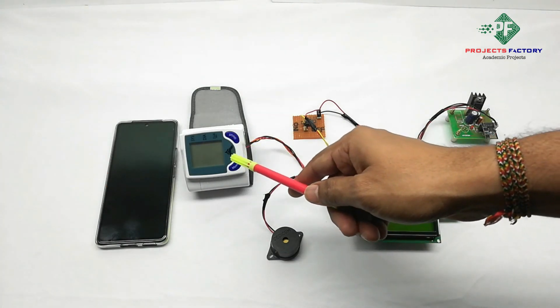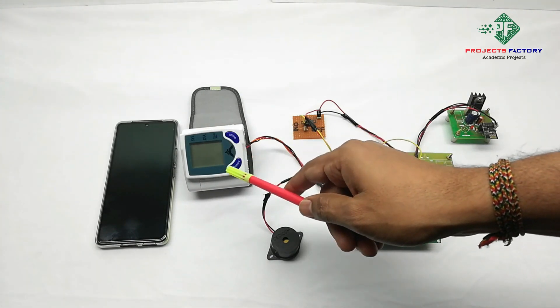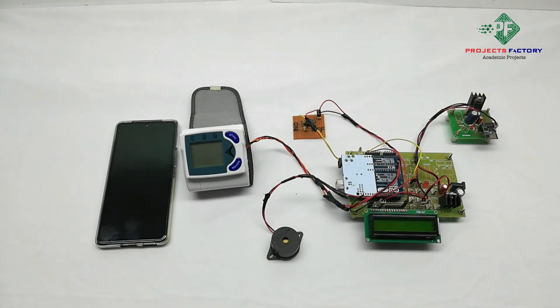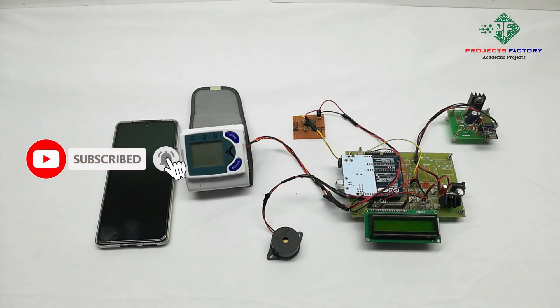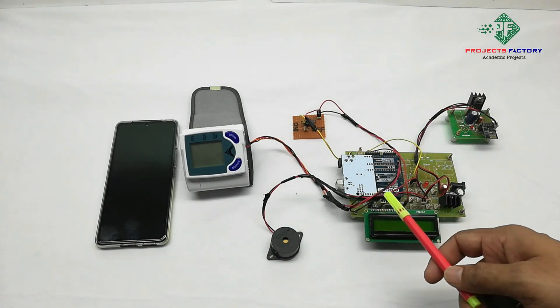We are using a cup-type BP sensor. It calculates systolic blood pressure, diastolic blood pressure, and heartbeat. It has a serial out and Arduino interface with the BP sensor through a UART port. There is a WiFi module, ESP8266, also interfaced with Arduino's second serial port. A buzzer is connected to the Arduino digital pin respectively.